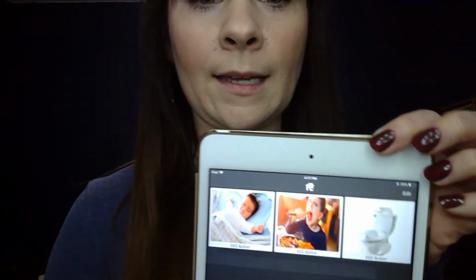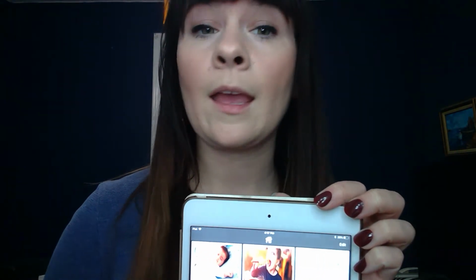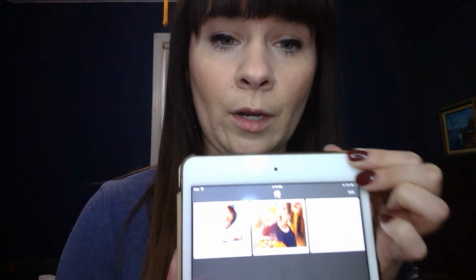So the next one that I would do is, let's say the client is really tired and really wants to go to bed. You could also do hand-over-hand prompting, so they can press this one. Sleep. And again, I programmed my voice to also say the word sleep. That way, perhaps in the future, if mom or dad says sleep or bedtime or something like that, the child could also respond to that as well.